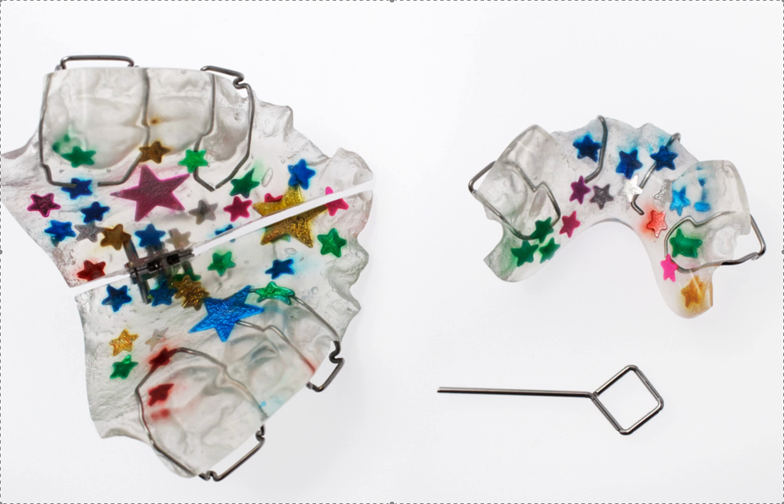So twin blocks are the OG appliances to help grow a lower jaw. And you can get them all pretty and decorated, and they work really well in the littler kids, the 6s, 7s, 8s, and 9s, maybe 10s, maybe 11s, now we're pushing it. Of course, you need to know if your patient is still growing. If your patient is not growing, it's not gonna work. So you need to do your own research.